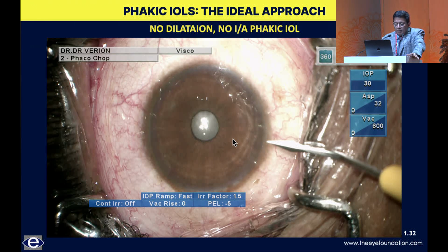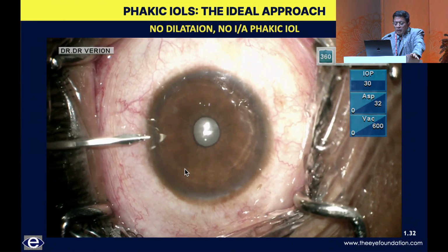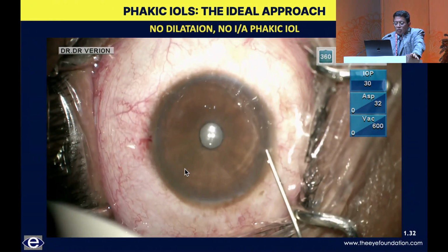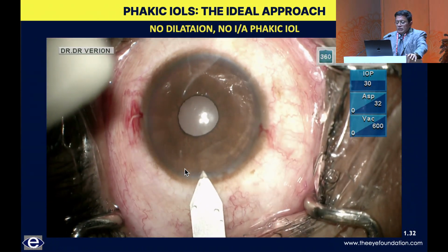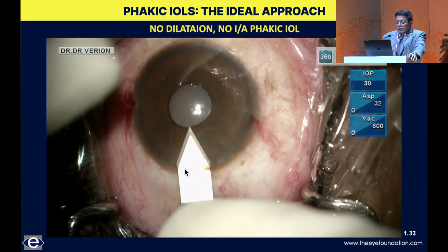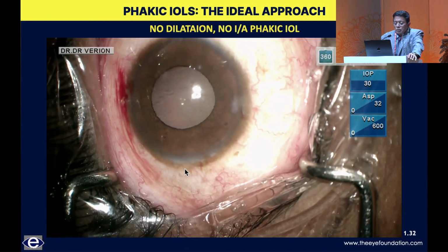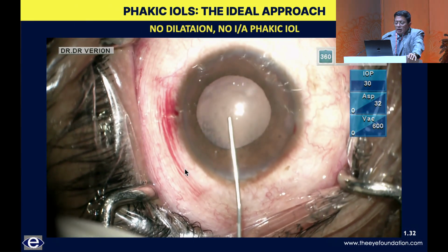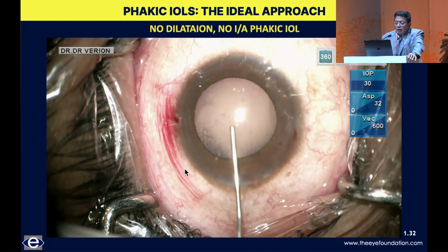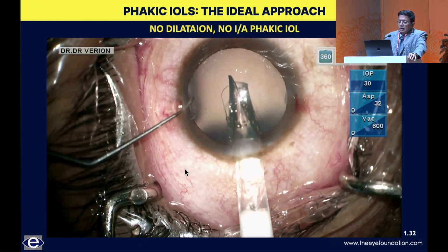So I like to have the pupillary iris cover on the lens. These are 1 millimeter incisions being done at the 3 o'clock and 9 o'clock meridian. I am seated temporally. That's a little bit of saline being injected. This is a 3 millimeter incision being made. I always make a 3 millimeter incision because I don't want a wound assisted implantation. Subsequently, a phenylephrine and xylocaine mixture is injected, and usually in these young myopes, the pupils dilate very well. What I'm using now is a cohesive viscoelastic, and you can see an excellent dilatation.